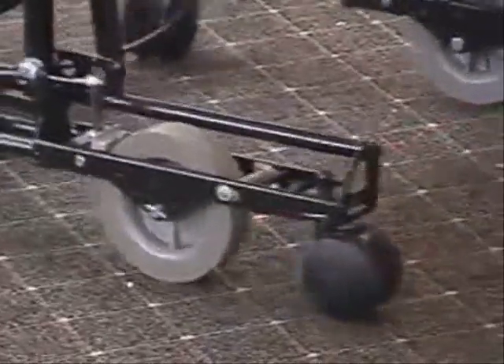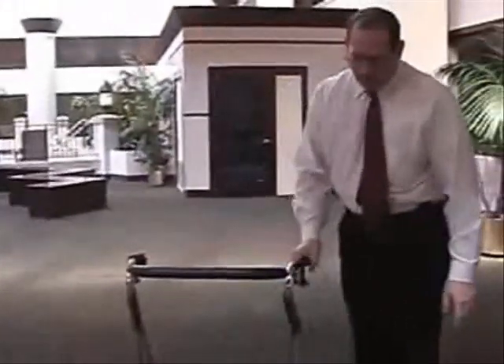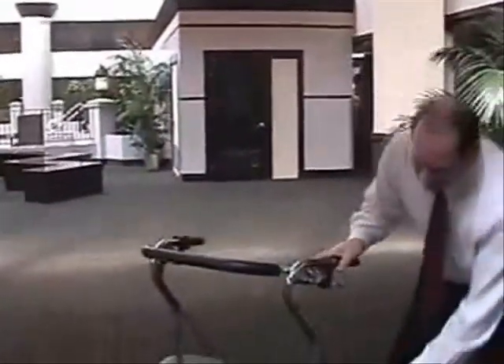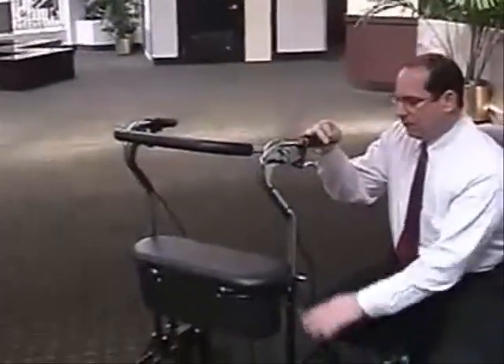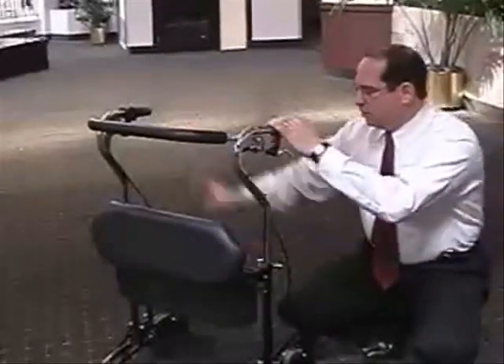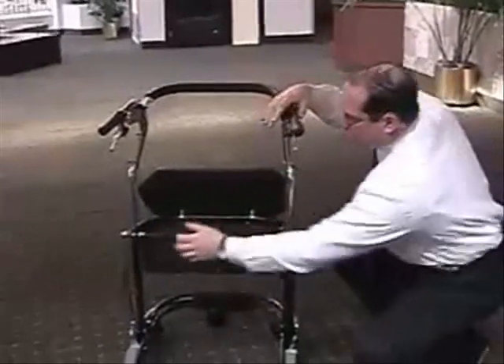When they are not freezing, they can of course turn it off and just use it like a walker. The unit is height adjustable — the standard unit is adjustable from 5 feet to 6'1", and smaller and taller units are also available. The unit also folds nicely for transport; just release these two levers and the unit will fold right up.